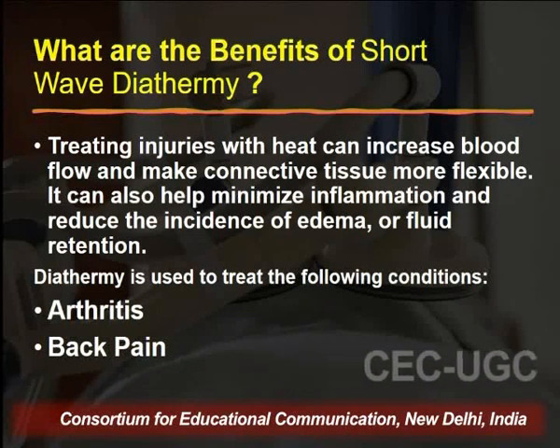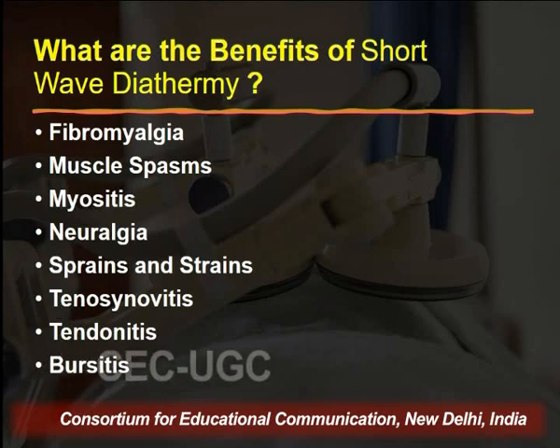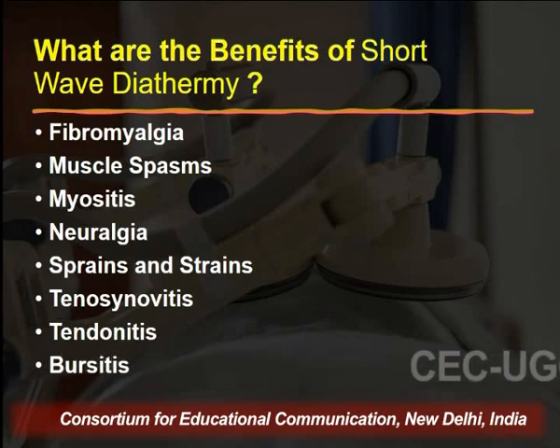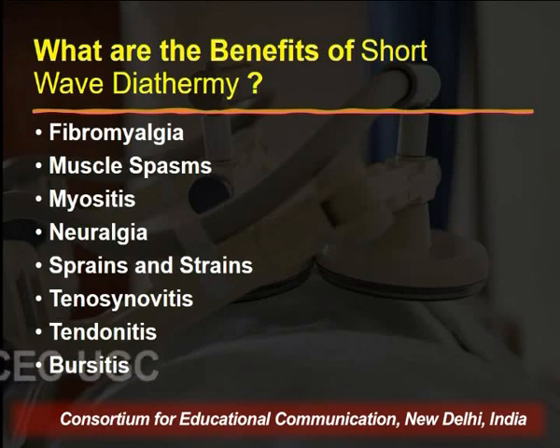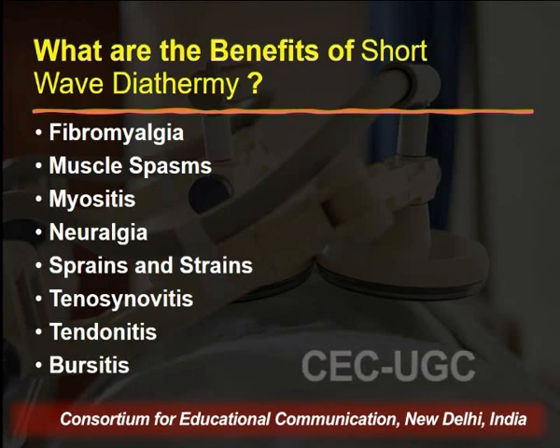So, diathermy is used to treat the following conditions: arthritis, back pain, fibromyalgia, muscle spasm, myositis, neuralgia, sprain and strain, tenosynovitis, tendinitis, bursitis.